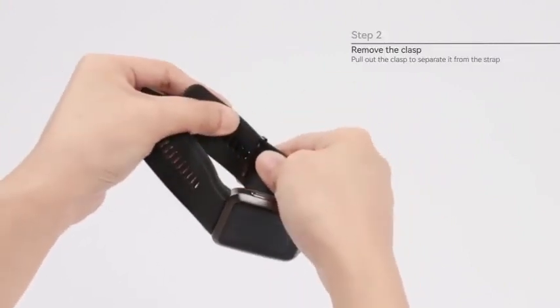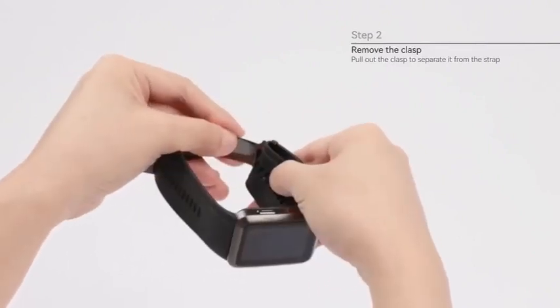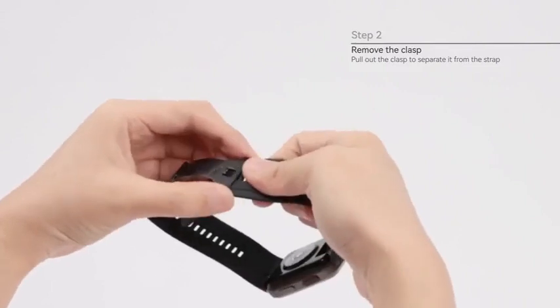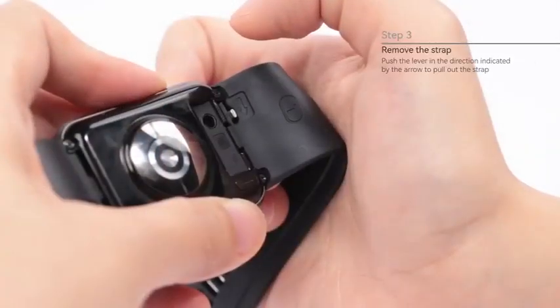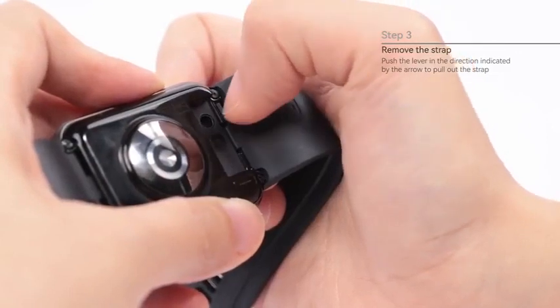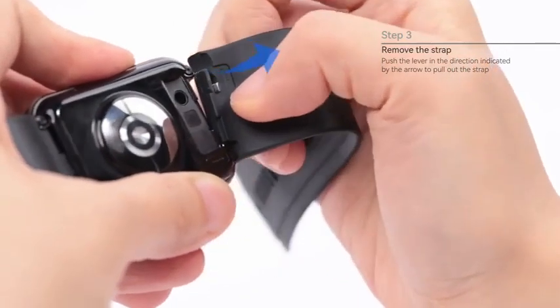Step 2: Remove the clasp. Pull out the clasp to separate it from the strap. Step 3: Push the lever in the direction indicated by the arrow to pull out the strap.